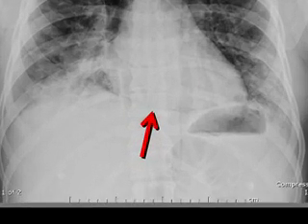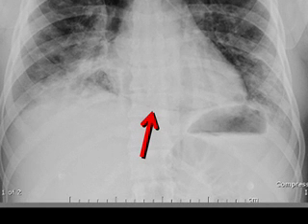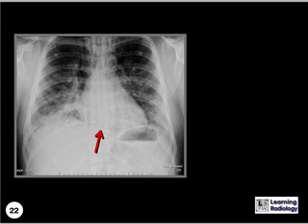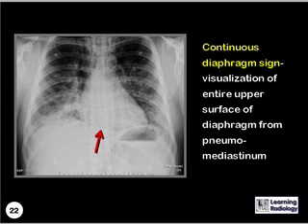The red arrow is pointing to what sign here? This is the continuous diaphragm sign, which is the visualization of the entire upper surface of the diaphragm from a pneumomediastinum.